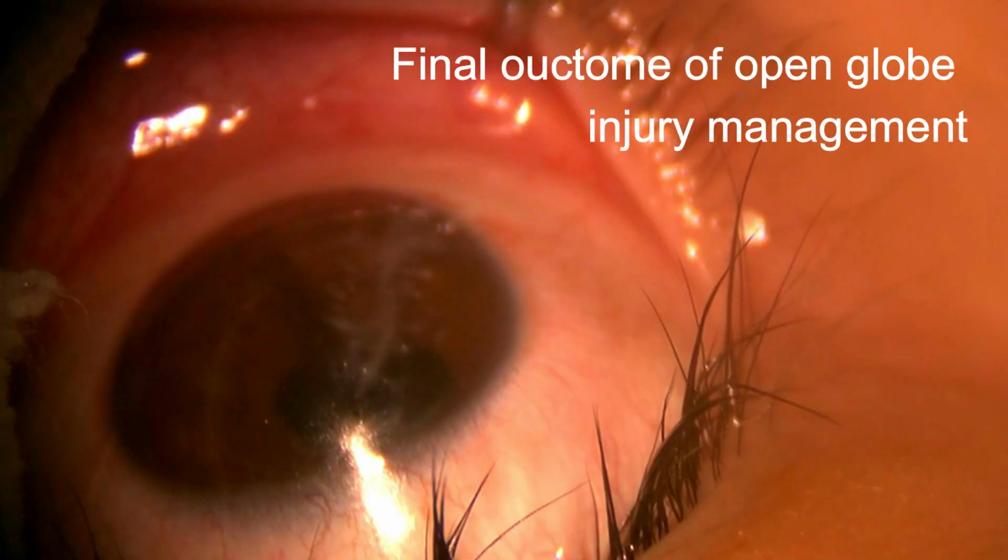This is the picture of the final outcome after suture removal.